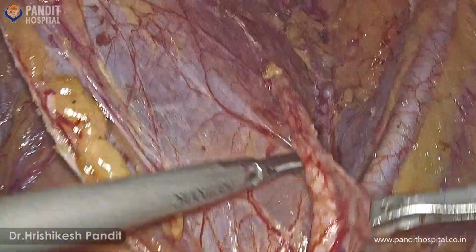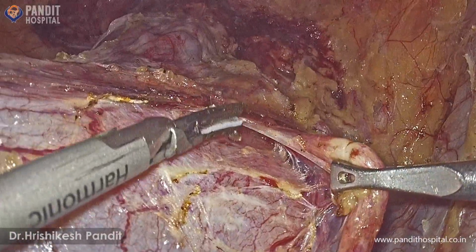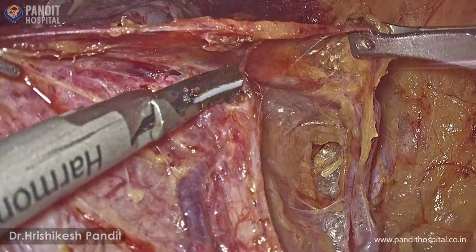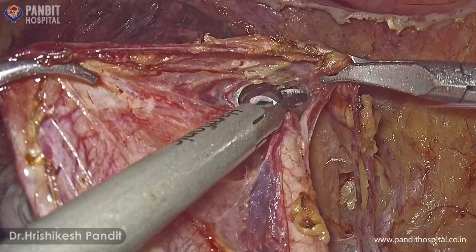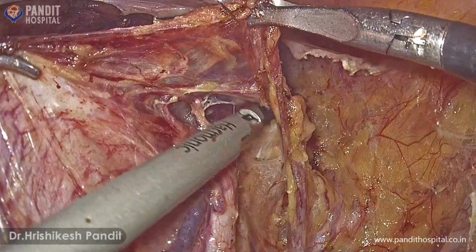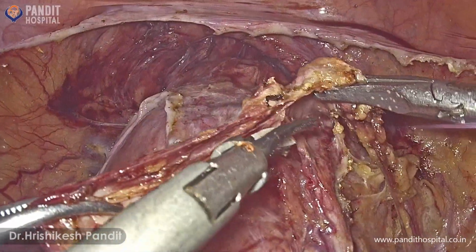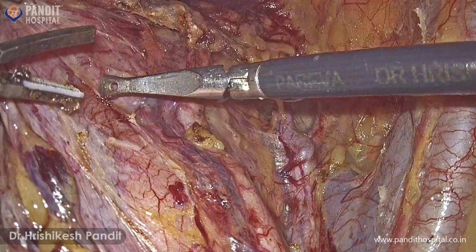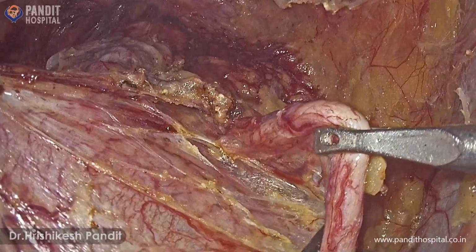Next step is lateralization of ureter, which is done from sacral promontory till level of uterine artery and further along the ureteric tunnel till the ureter enters into the bladder. Here we are creating space between ureter and uterine artery by blunt and sharp dissection. Ureter carries its own vascularity in a sheath encasing it known as the Waldeyer's fascia. Thus, while dissecting, one should take care to preserve the vascularity of the ureter.